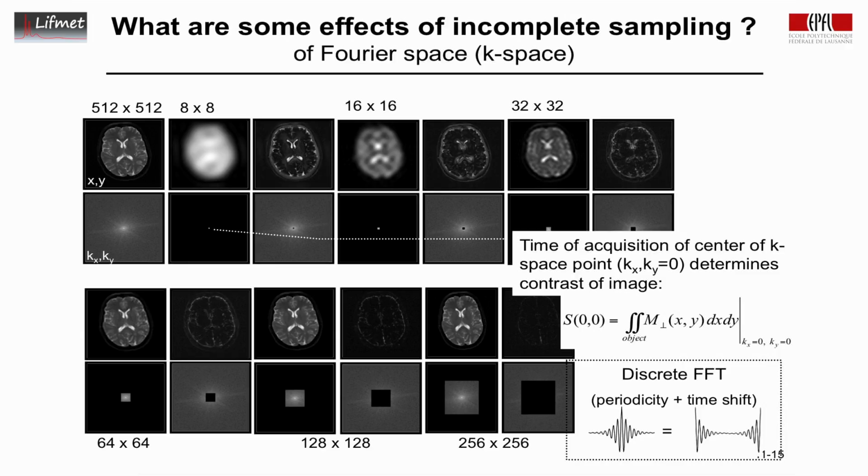So what this means in terms of data acquisition, if your subject moves close to the central K-space points, you're going to have a fairly big impact on the image, whereas if it moves at the edges, where there's very little signal, the impact is much less. So crossing through the 0 K-space point defines the contrast and also the magnitude of the motion artifacts.